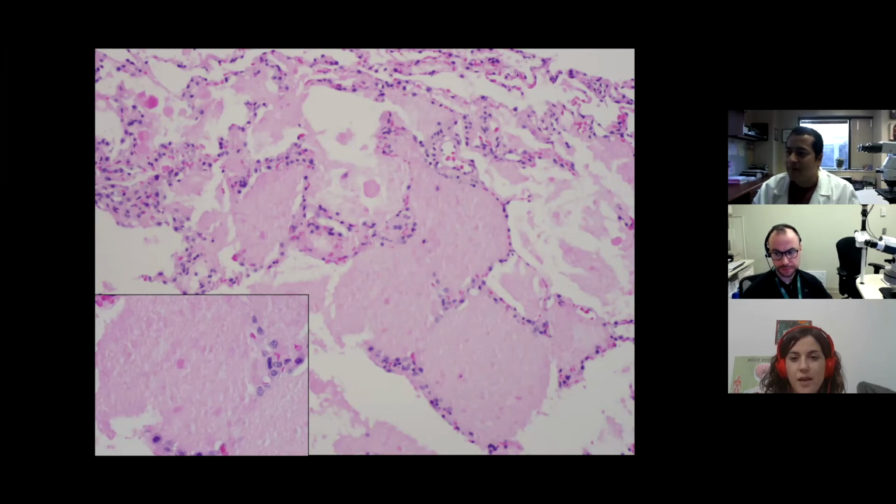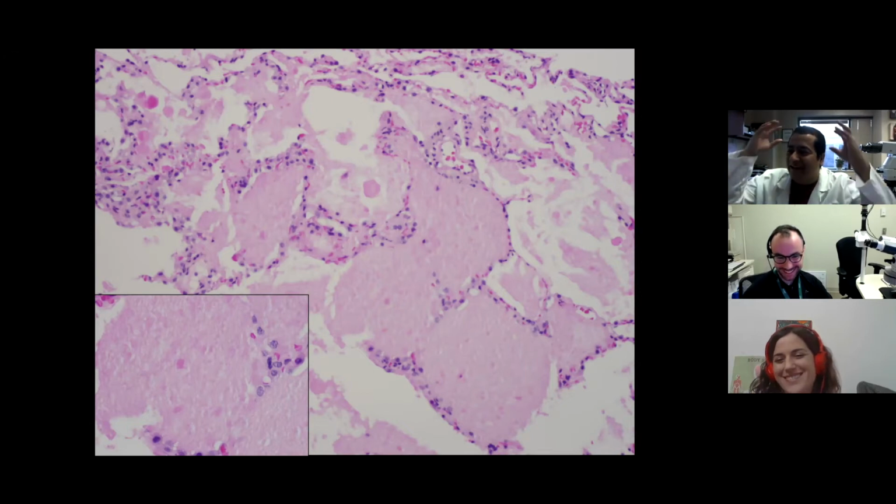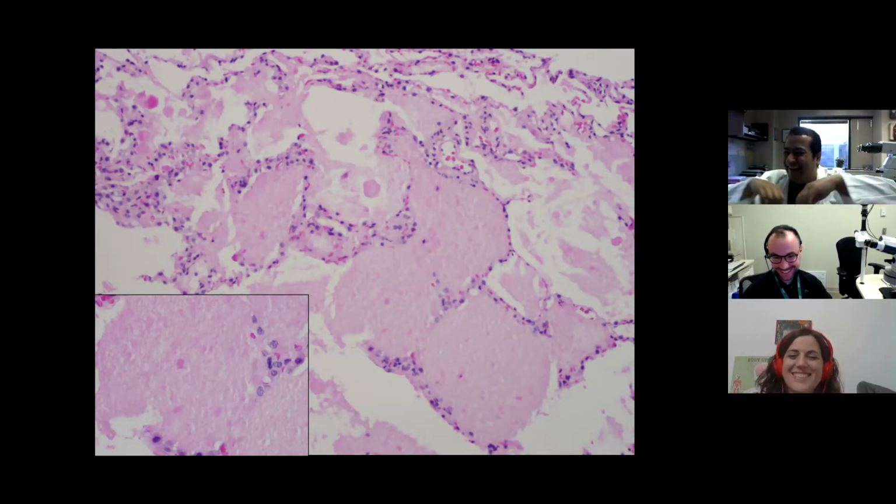Definitely. I would add the description that it looks like mashed potatoes with little vegetables in it. Nice. Little mental pictures, isn't it? Like the histiocytes in the dark. What was that for LCH? That was for the histiocytes that kiss in the dark. Yes, those histiocytes that kiss in the dark. Yeah, I like it. All right.